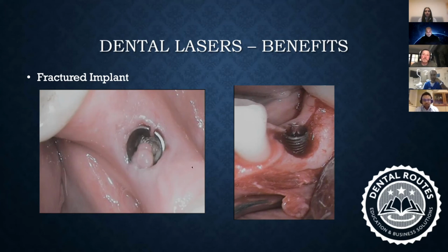Again, I'm talking about 10 to 12 months time by the time I would have finished a case like that. But in this case, I was able to take the implant out on the same day, disinfect the whole socket completely as soon as I took the implant out. I was able to recreate the osteotomy site properly and place my implant in the socket on the same day. And that's with a lot of confidence. There is no thought in my mind saying, oh, will it work? Will it not work? Will it get disinfected? No. I know for a fact that this will work.